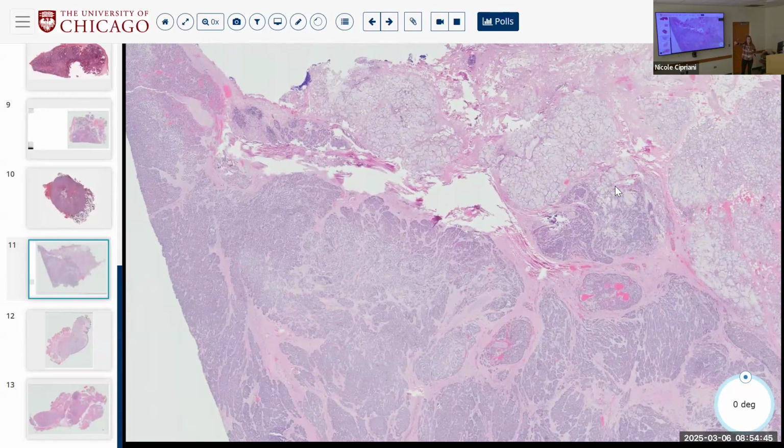Negative, so polymorphous is monophasic, P40 negative. c-KIT, same problem, probably patchy, and patchy could be positive. S100, usually strongly positive. Mammaglobin, negative, exactly. That could be a good help if you're trying to think about a monophasic thing, secretory versus polymorphous. Mammaglobin will be differentiating here.